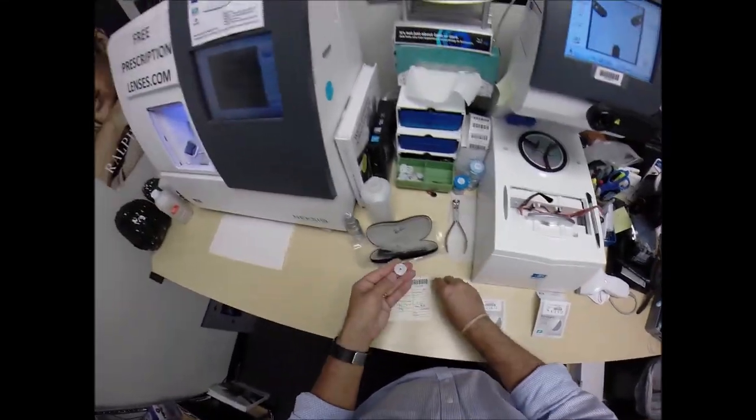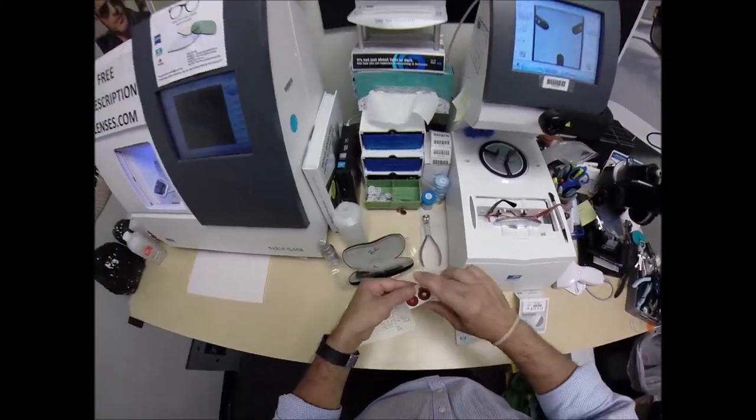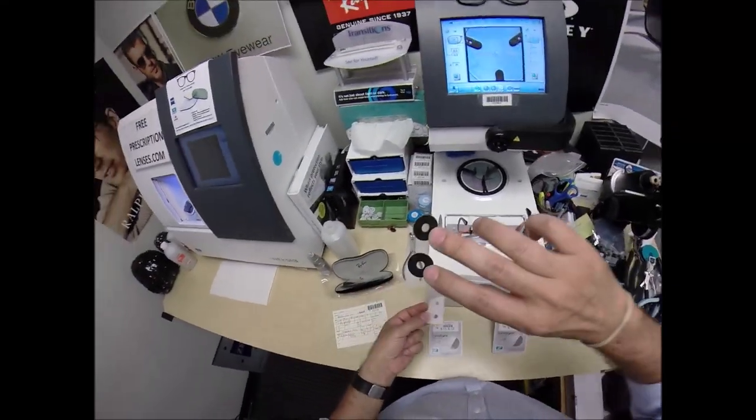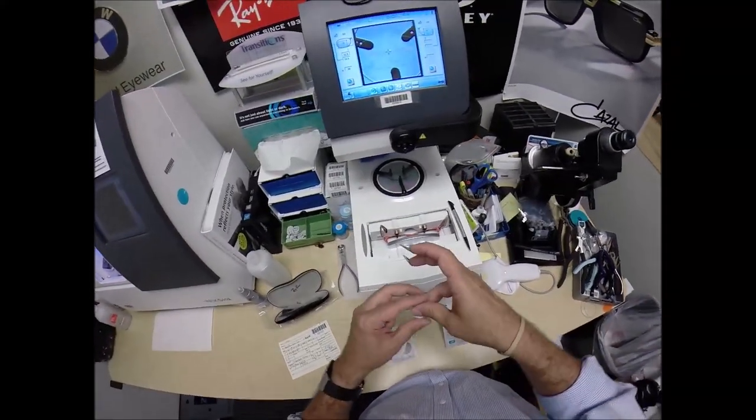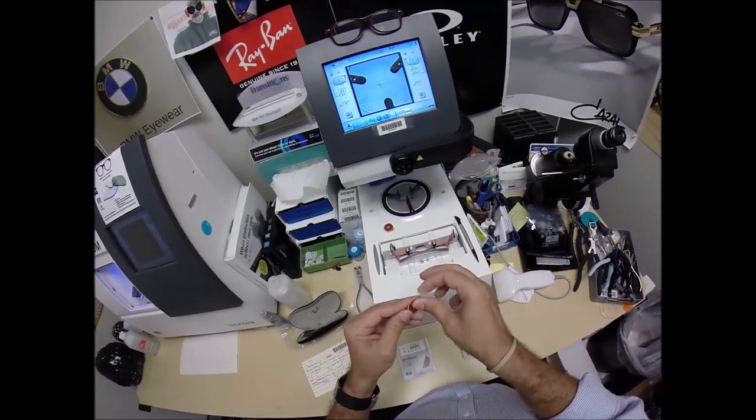And this is a blocker, as I like to call it, Jenny from the block. I need to attach this to your lens while it is cutting. So I need 2 double-sided adhesive stickers, of which I've got them here. The black side is the sticky side. We're going to stick this onto the first block. Do the same thing now for the second one.